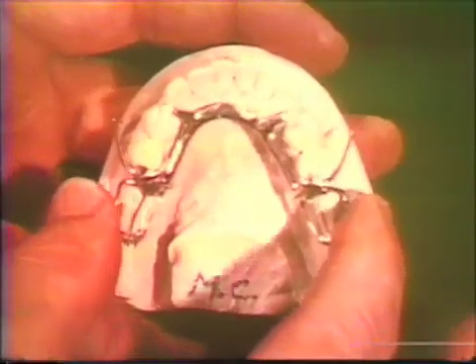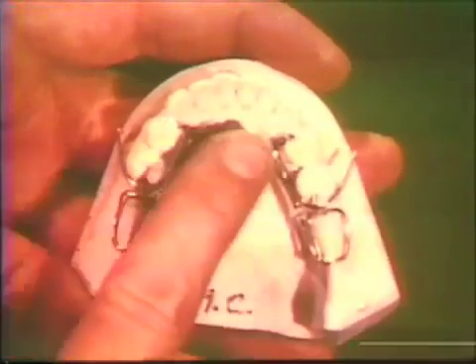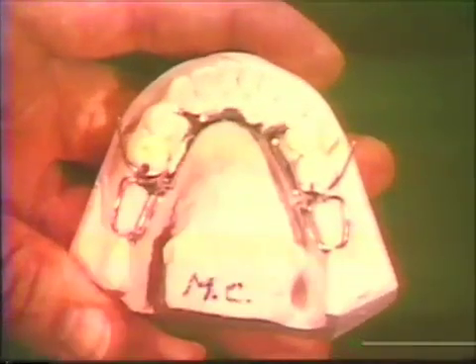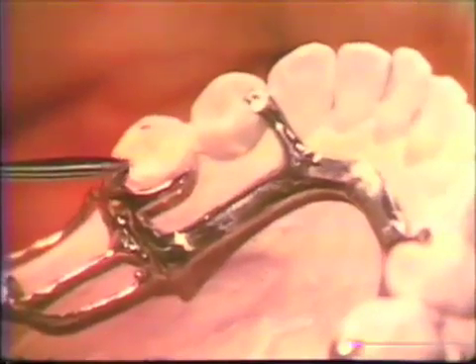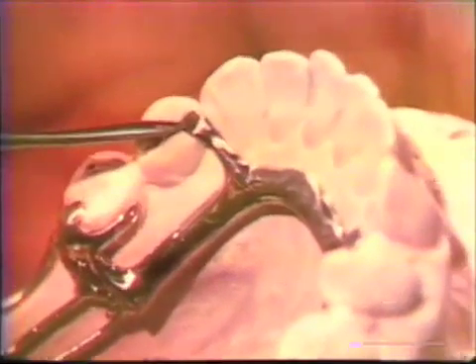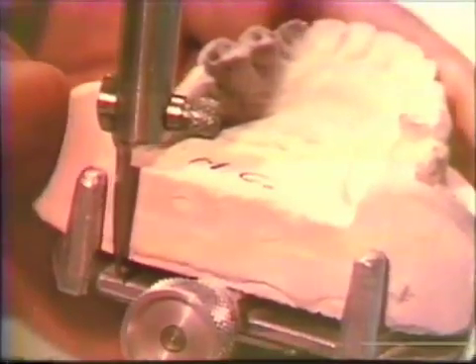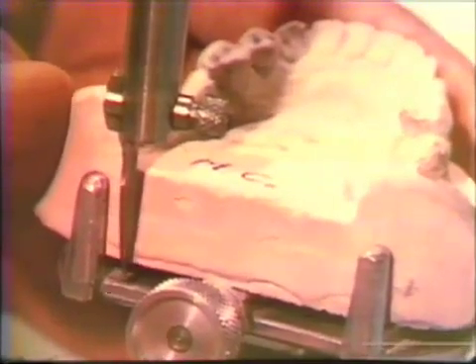Following these adjustments, the appliance should readily seat on the master cast. The positions of the occlusal rests are inspected to determine the accuracy of fit. The master model is now returned to the dental surveyor and positioned according to the original scored survey line.